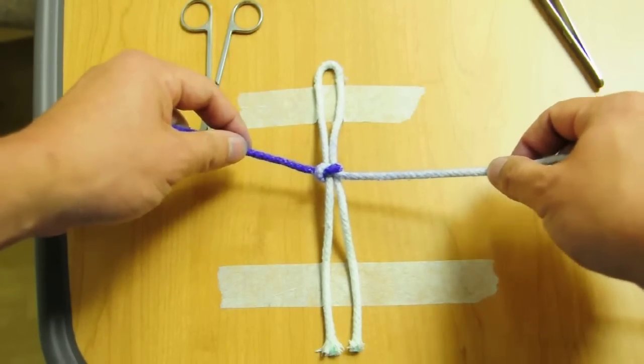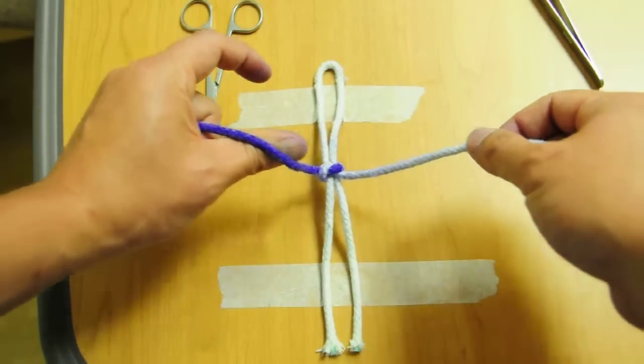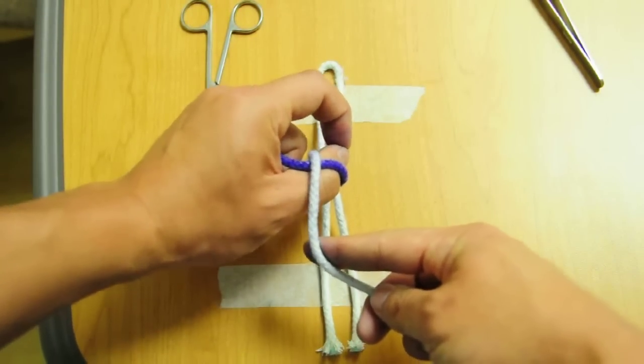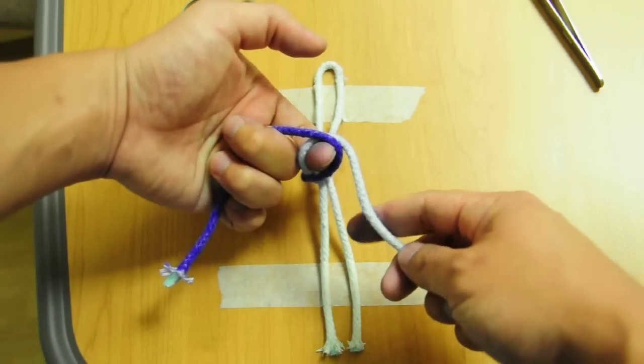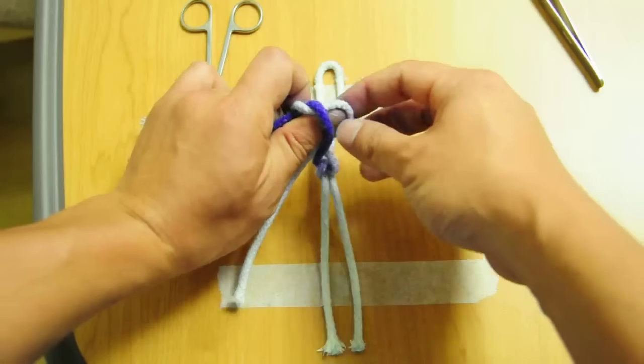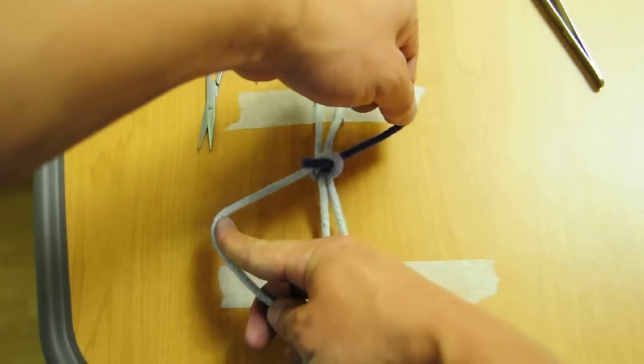Now, because you've got to remember, I did an index finger pass, now I've got to do a thumb pass. So take my thumb, cross under, always under with your thumb, close the loop, come to the other side, grab the suture, push it through with the thumb, and pull it out. And then cross your hands to lay it nice and flat.